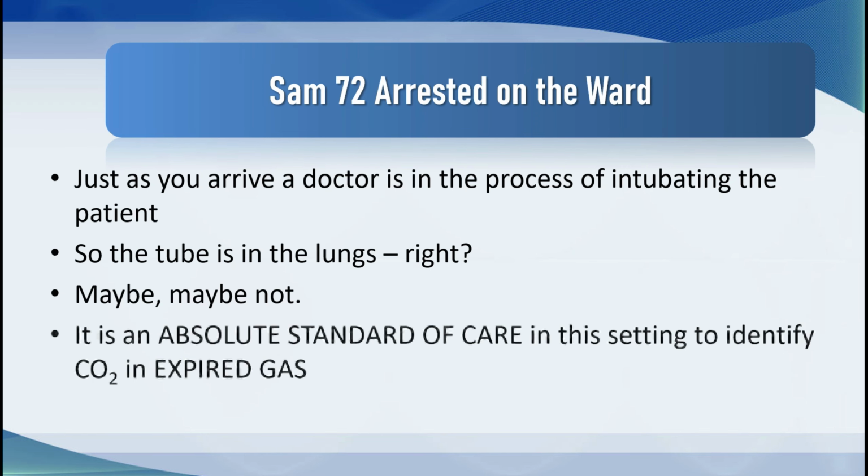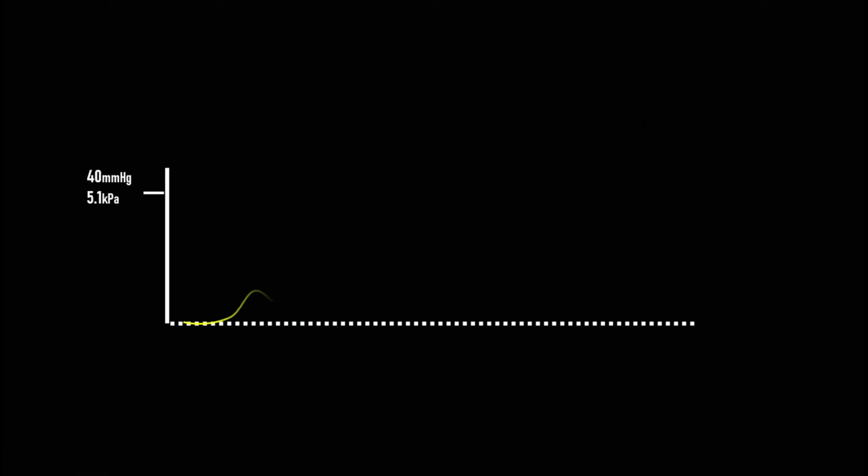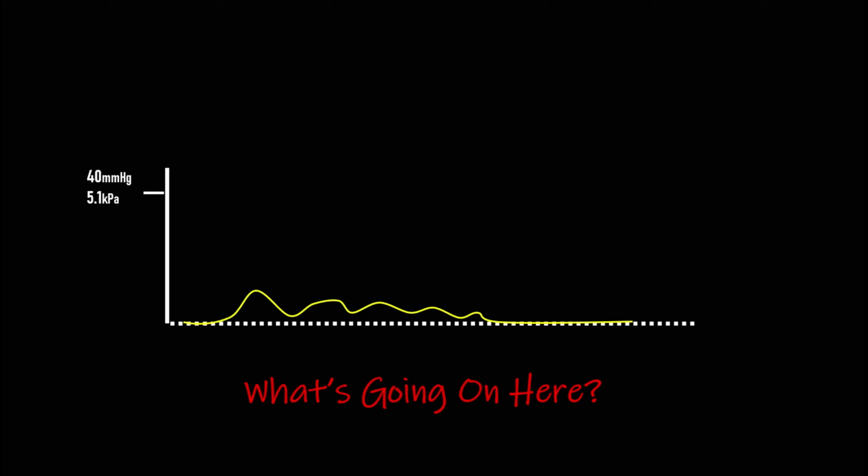It is an absolute standard of care in this setting to identify carbon dioxide in expired gas. So let's have a look at the capnograph. It looks like this. What's going on here? Well, this is an esophageal intubation.